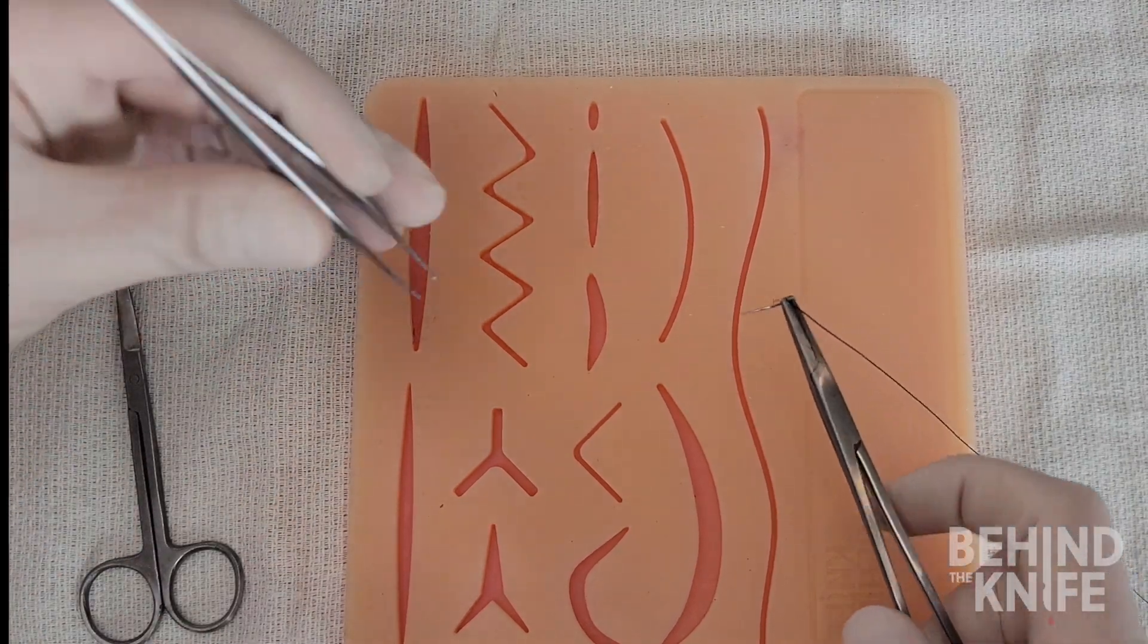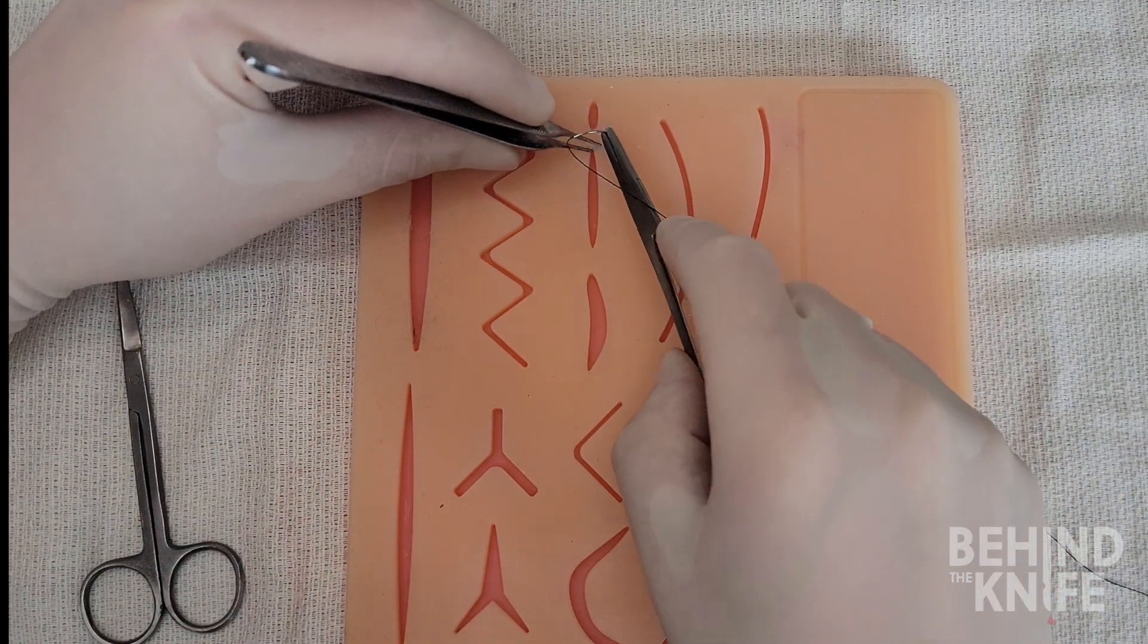We're going to start by picking up our needle drivers and loading our needle into them in an orientation for a forehand throw.